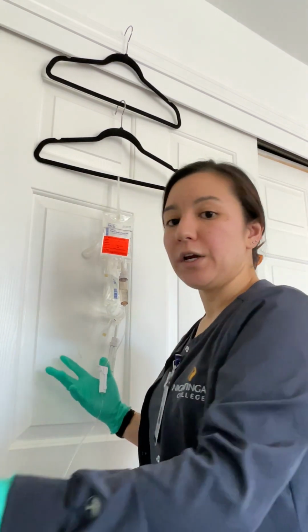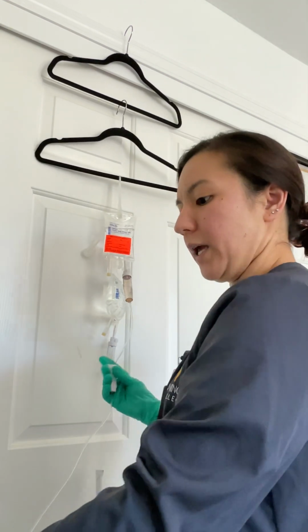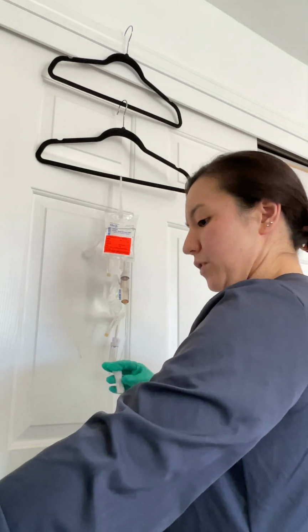Alrighty, so now we're going to do our drops per minute. So this one will be 100 drops per minute. So we're going to count for a full minute of 100 drops going into the drip chamber.